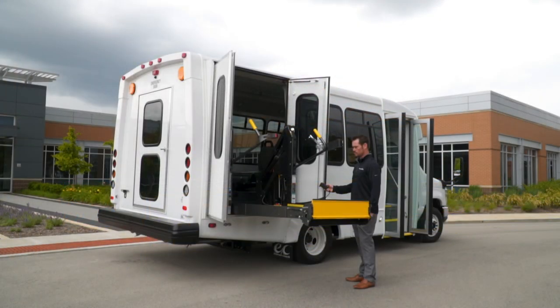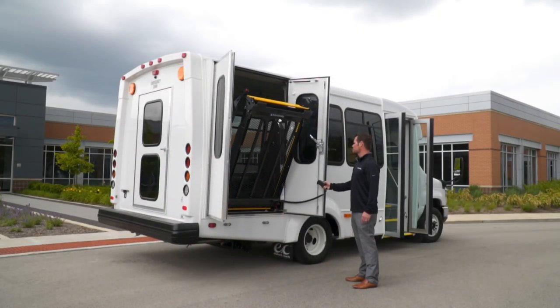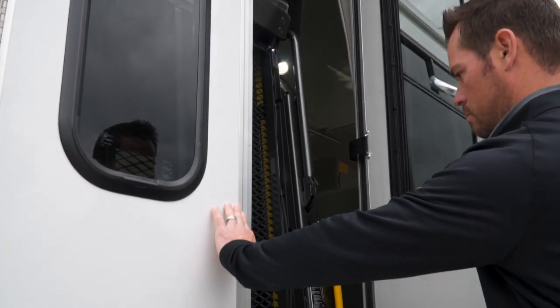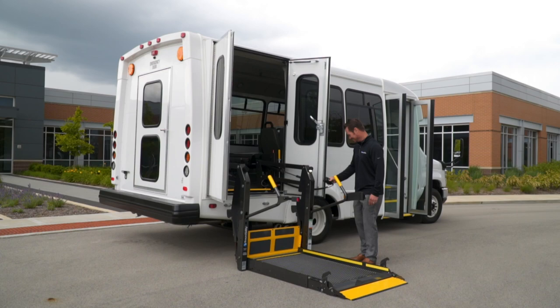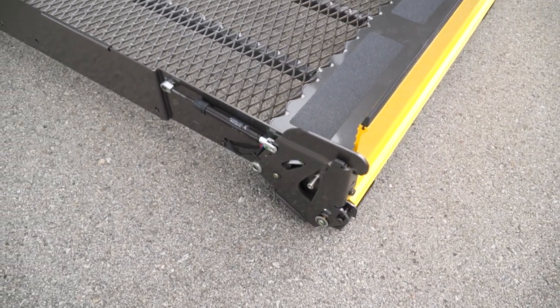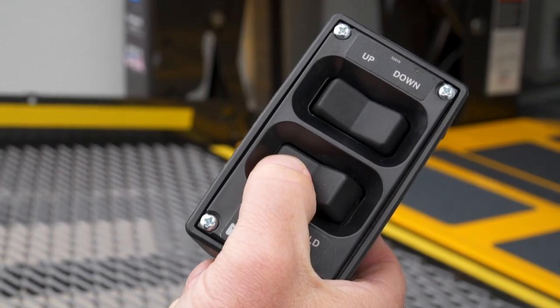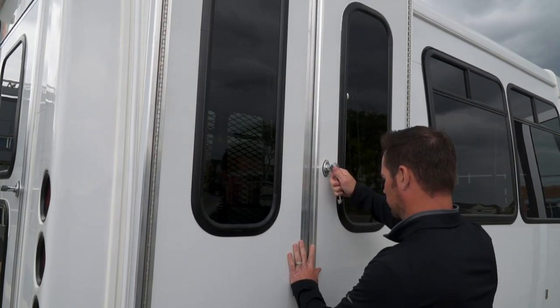To return the platform to its storage position, be sure the lift and storage areas are clear and the handrail belt is unbuckled if equipped. Then simply press and hold the fold button on your handheld pendant until the platform is fully stowed and all motion stops. Check to make sure your vehicle doors are fully closed and secured. If returning the platform to its stored position from ground level, check to be sure the platform area and vehicle storage area are clear, then press and hold the up button until the platform reaches vehicle floor height and all movement stops. Then press and hold the fold button again until all motion stops, and close and secure your vehicle doors.